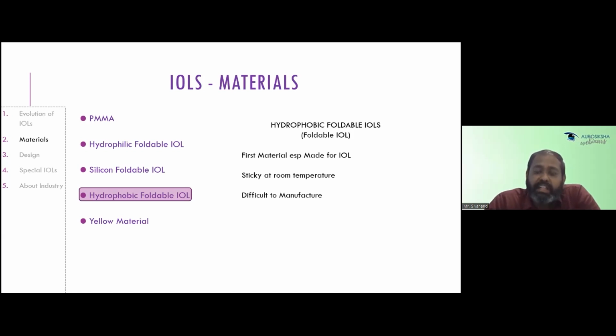Okay. It is actually sticky at room temperature, usually between 30 to 35 degrees, it is very sticky. That is why it is even more difficult to manufacture hydrophobic lenses. And hence you will find that the hydrophobic lenses are costlier than the other PMMA and hydrophilic lenses.